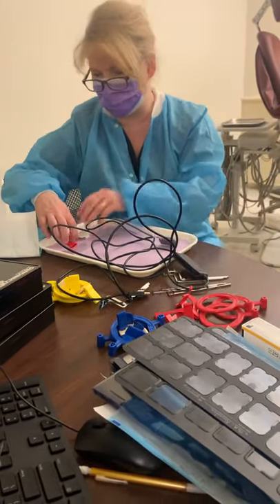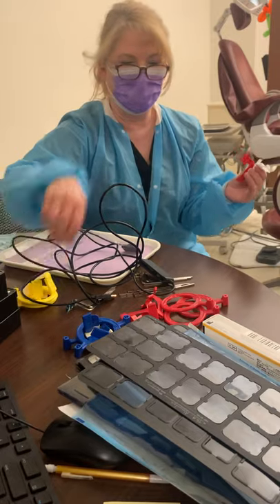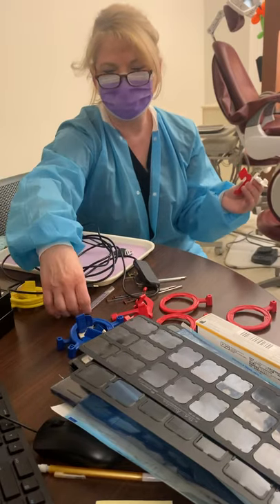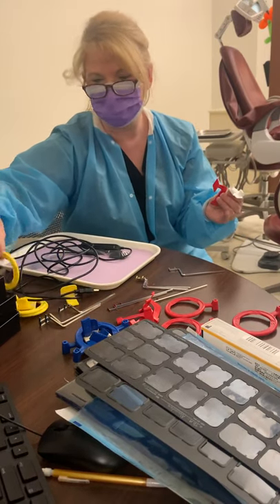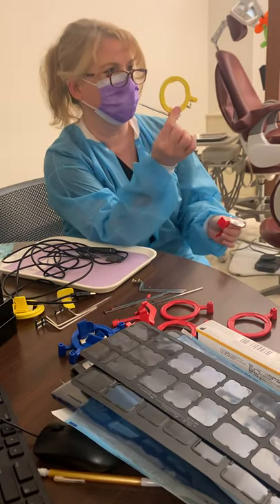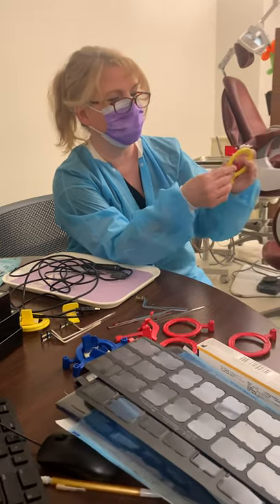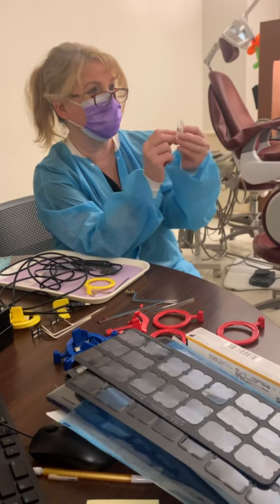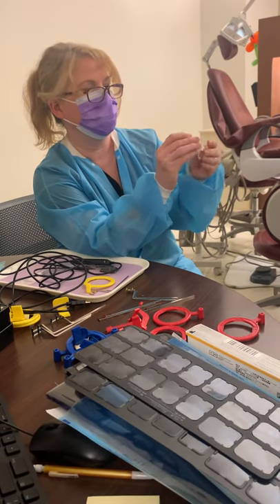What's different is the type of bite block that you use. We have a ring, we have a bar, and we have a bite block — posterior, anterior, and bite wing. You would still use your same posterior ring and bar. Your ring and rod — rod or bar, depending on who you're talking to — would be the same, but what might be different is this piece and how you put your sensor into your bar.